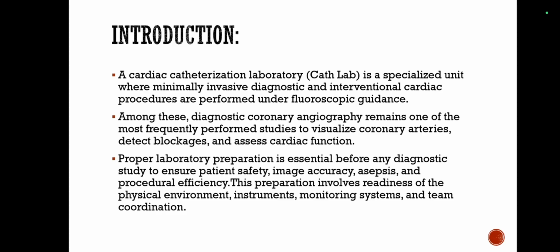So introduction. A cardiac catheterization laboratory is a specialized unit where minimally invasive diagnostic and interventional cardiac procedures are performed under fluoroscopic guidance. So, cath lab is a place where we do small interventional diagnostic procedures like coronary angiogram, angioplasty, balloon valvuloplasty, and a few other procedures too.